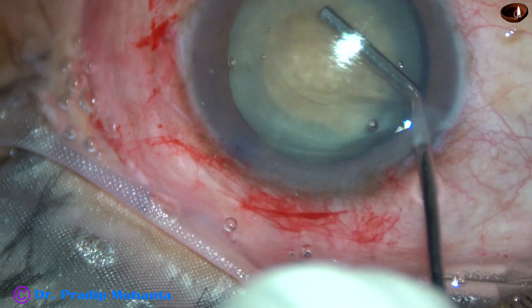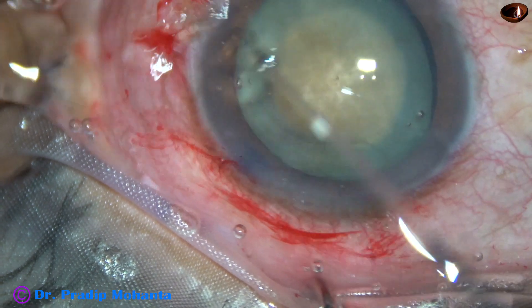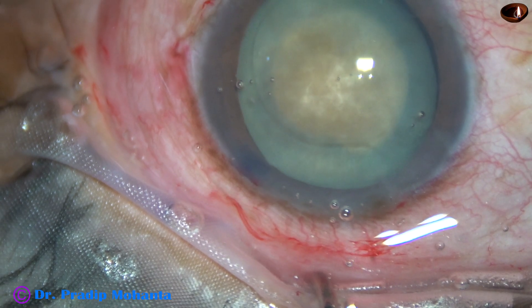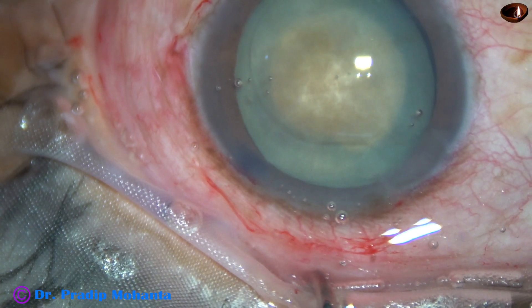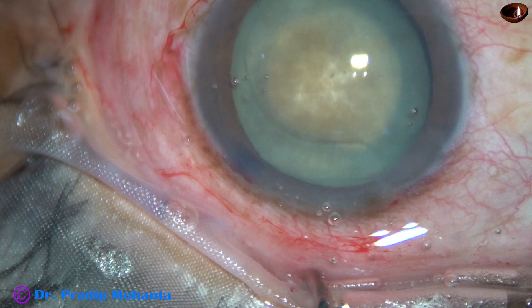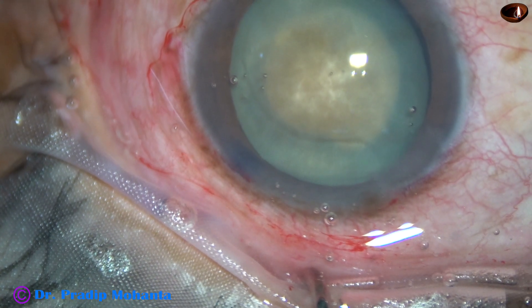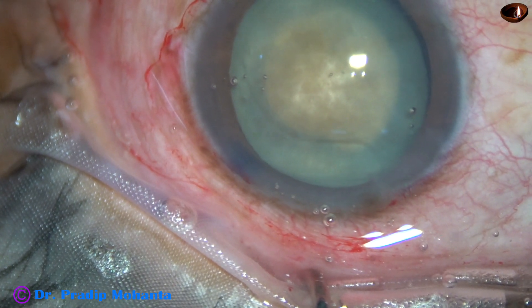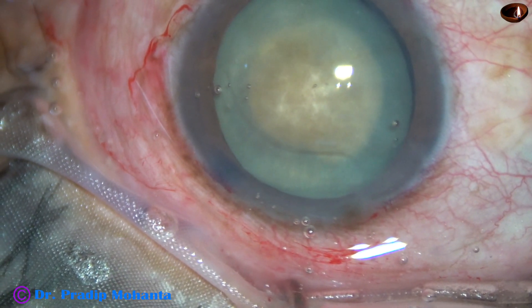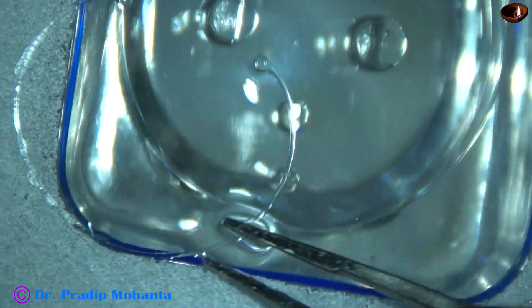Nucleus management will be a bit difficult with a small rhexis. Visco is again filled and visco from the ocular surface is washed away. Now is the time to apply a capsular tension ring — that is a CTR. In my opinion, the CTR should be applied before nucleus management because the FACO probe will push the nucleus, will crack the nucleus, and all these maneuvers will cause zonular stress.